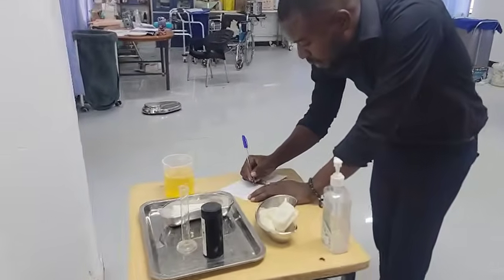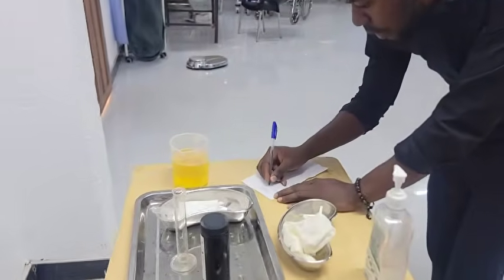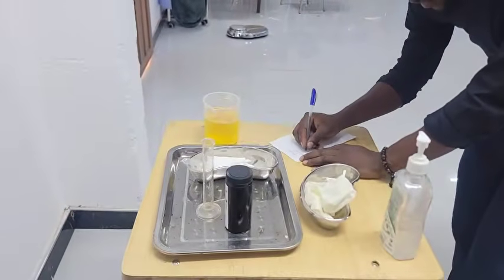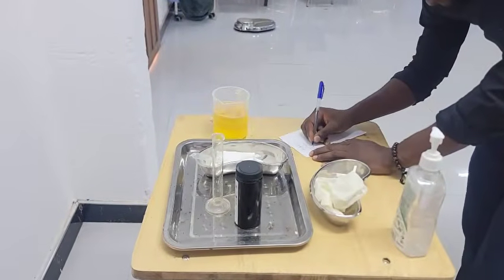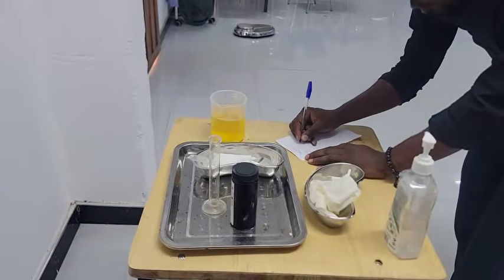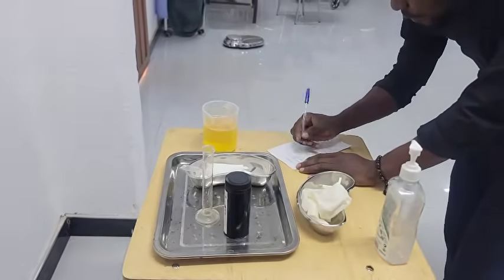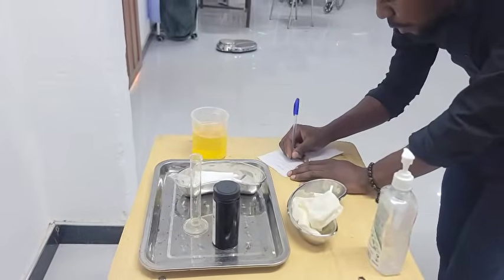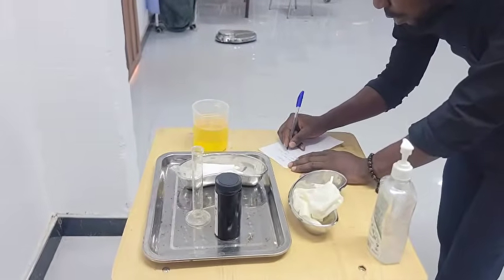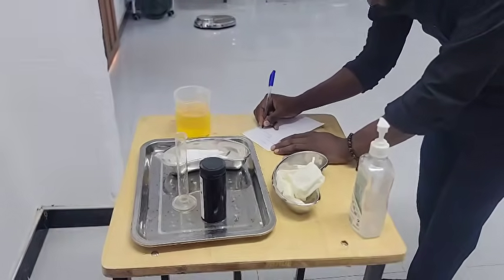So for the physical properties, we said the amount is 400 mils. The color, which is a clear amber or straw amber. Then the smell is aroma or aromatic, if you like.